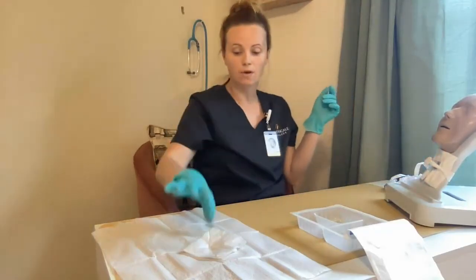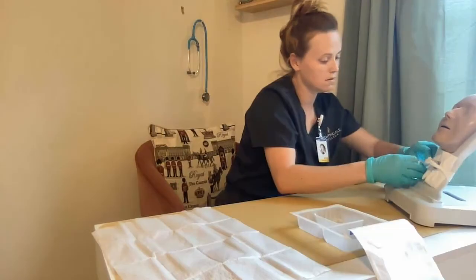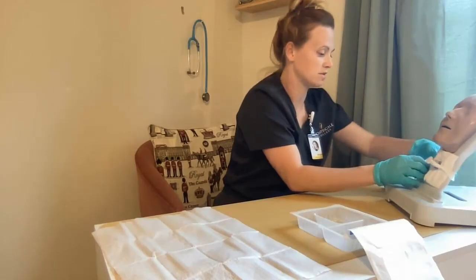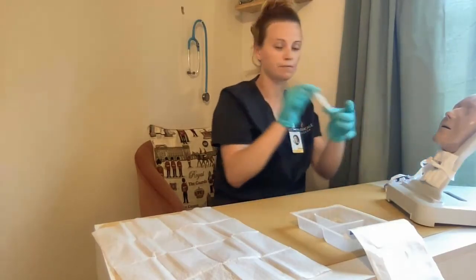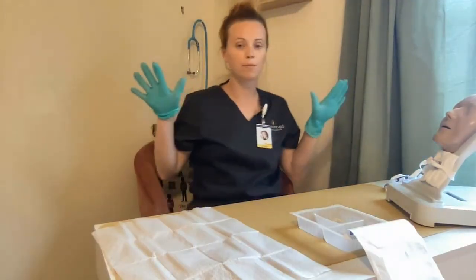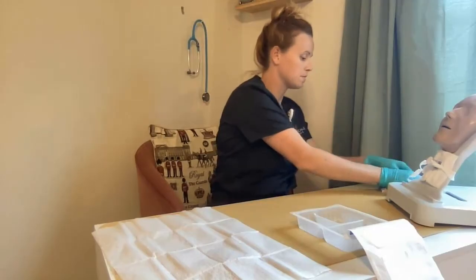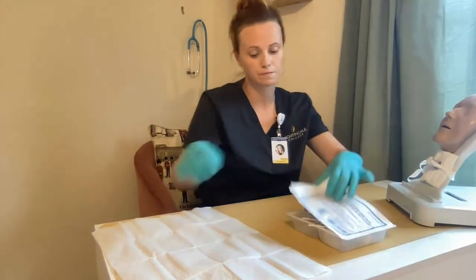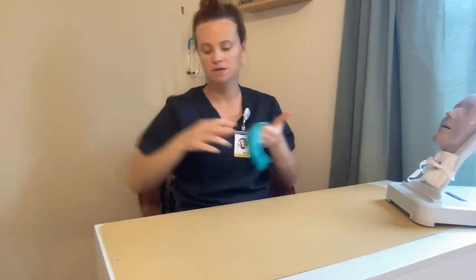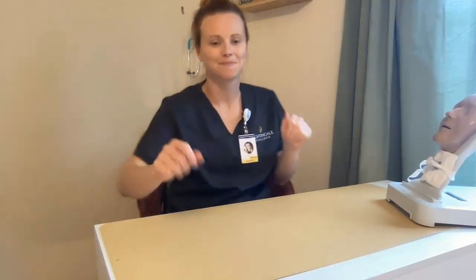Lastly, I want to get the remaining gauze, hold it in a square, and place it underneath the knot that I created to protect the patient's skin. Then I'm going to get my tape and place it over the knot to secure it in place. I then want to lower my patient's bed to the lowest position, gather all my supplies and dispose of them, remove my gloves, perform hand hygiene, and make sure my patient has the necessary things that they need.